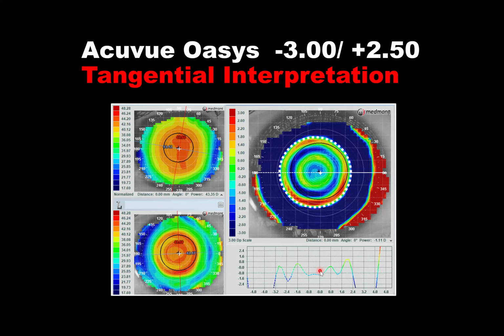Mire qué interesante, con un topógrafo, donde usted puede crear un mapa como este, si ese paciente está teniendo problemas con uno o más diferentes tipos de lentes multifocales, el mero hecho de tener un mapa como este nos indica que hay esa descentración, y esa descentración puede causar obviamente aberraciones ópticas, las cuales pueden bajar la calidad visual de ese paciente y que el paciente no está trabajando bien con un lente, en este caso multifocal.